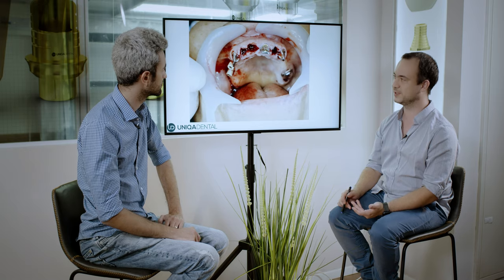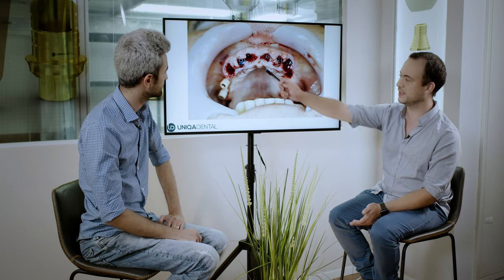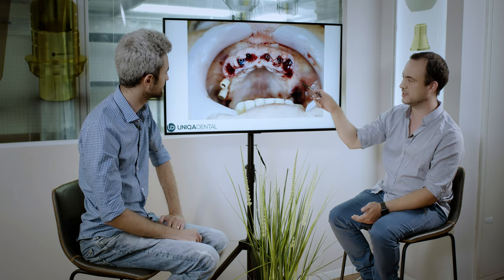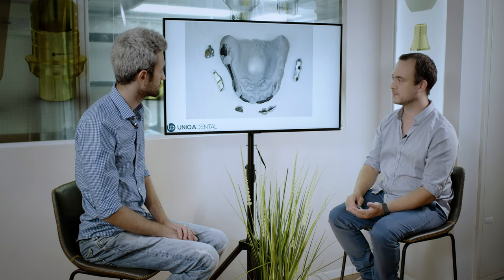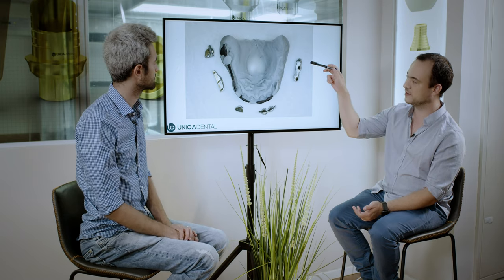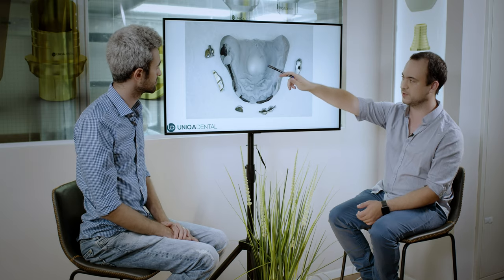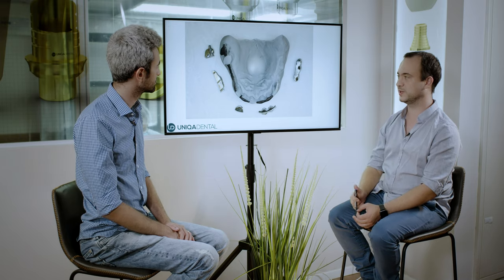The next photograph shows the implants without the teeth. You can see the implants that were placed. There was another implant placed distally that we didn't want to load, because the span and all the pressure on the last implant would be a problem. Here you can see the model with all the parts — the implants with part of the bar, the parts of the bar we cut away, and the teeth we took out after extraction.